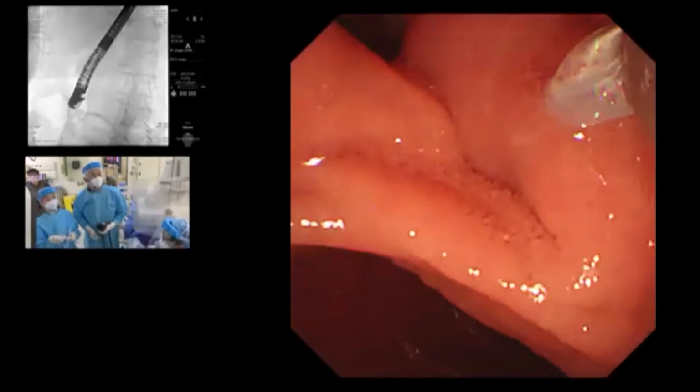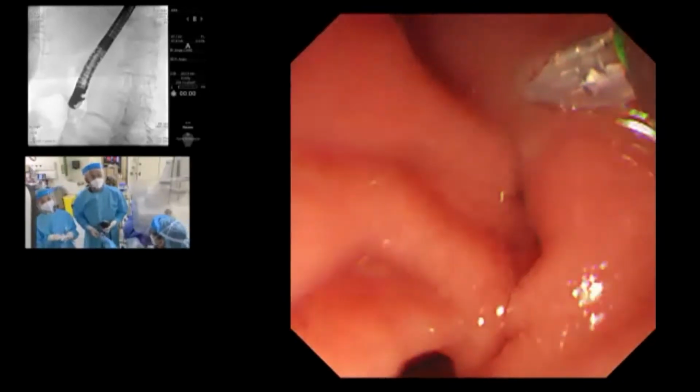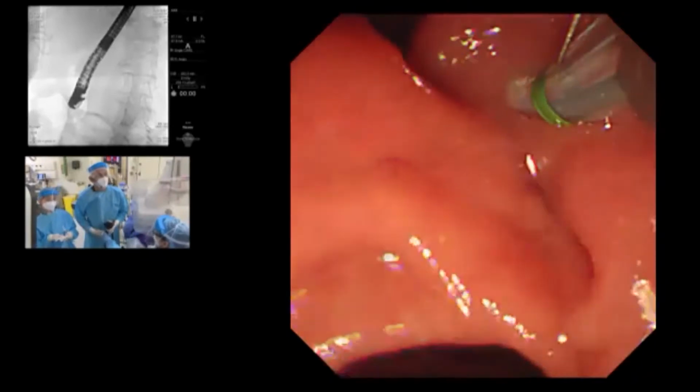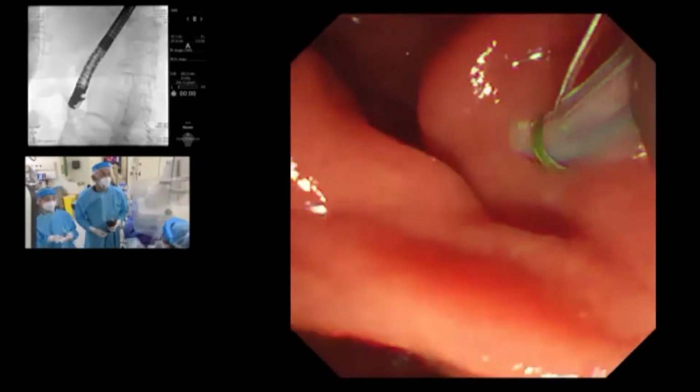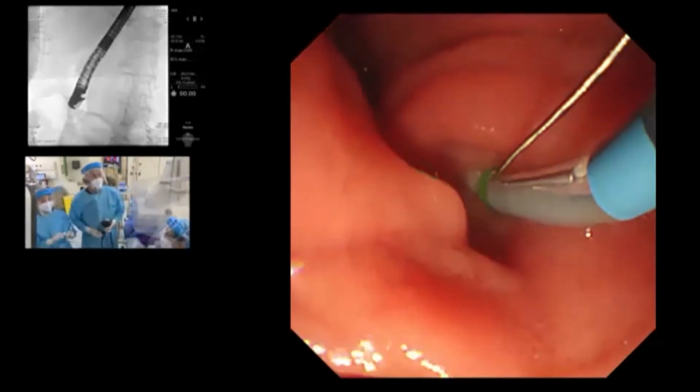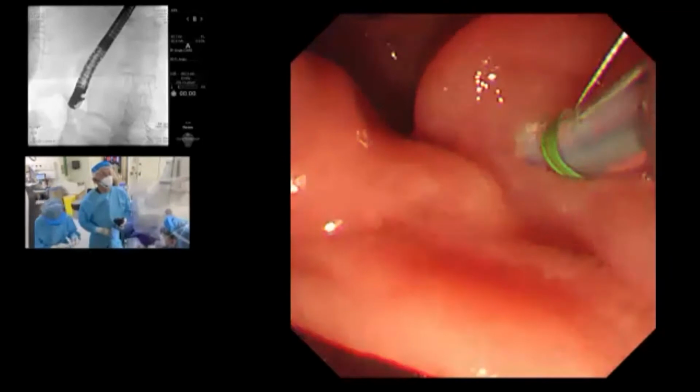Okay. Anthony, how long would you try before you go to a pre-cut? Is there a cutoff you have, attempts, minutes, or anything like that? Usually around 10 to 15 minutes, I will have pretty much tightened. I would pretty much have an idea whether I could get inside or not.